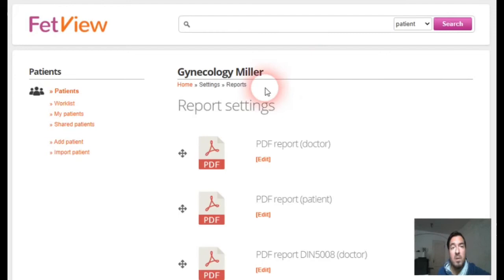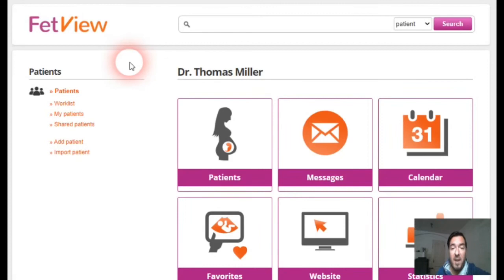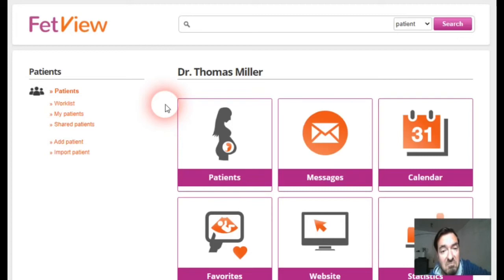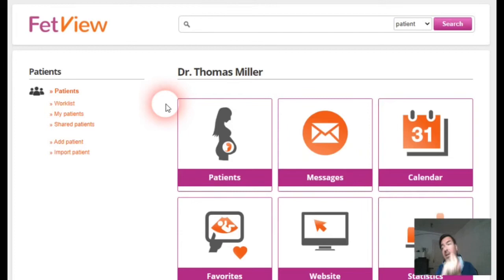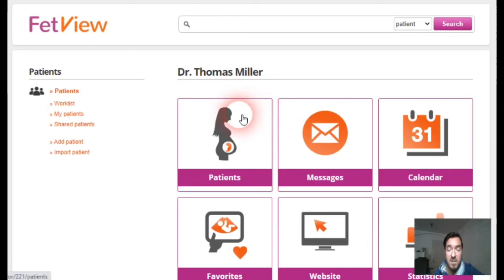At the end of this video I want to tell you something about the placing of the reports. Normally it would be very hard to find a report — you would have to search for the patient first, then search for the right examination, and then search within the examination for the report. So we made it much easier.